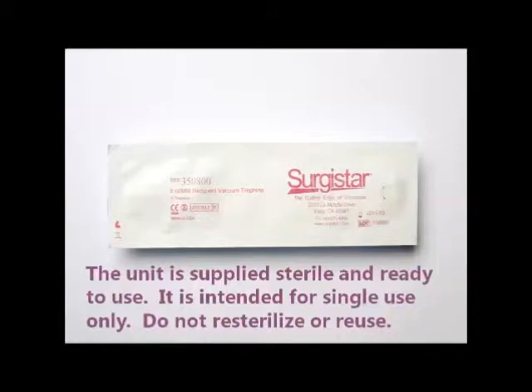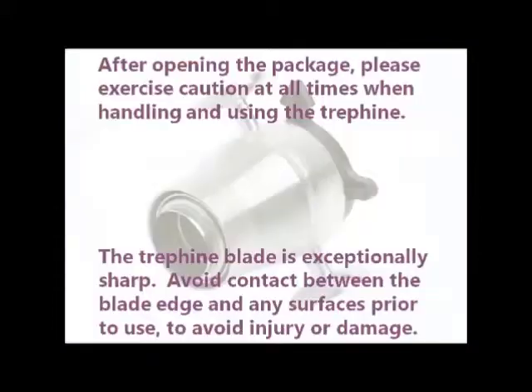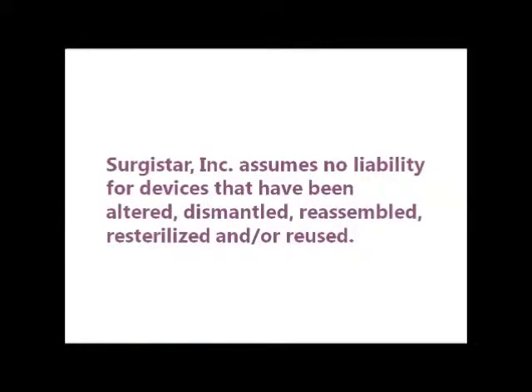Do not re-sterilize or re-use. Carefully inspect the packaging and do not use if the package has been opened or damaged. The blade is exceptionally sharp, so please be careful when handling. Avoid contact with any surfaces to avoid injury or damage.